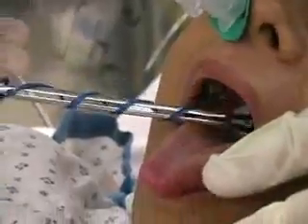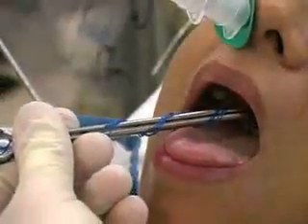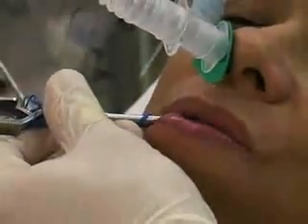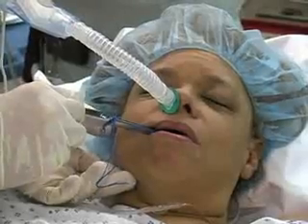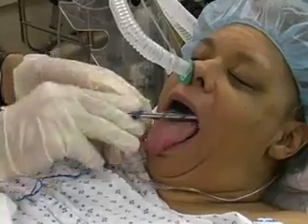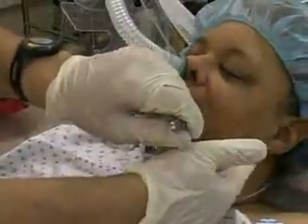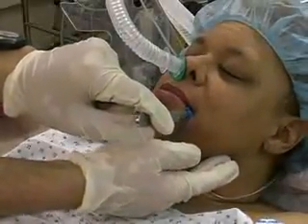Direct the forceps toward the piriform fossa, the small recess located on either side of the larynx within the hypopharynx. Apply the cotton pledgets to the laryngeal mucosa in the piriform fossa. Hold the pledget in place for 90 to 120 seconds. Repeat this process on the contralateral side. Palpate the inferolateral aspect of the mandible to confirm the correct location of the pledgets.